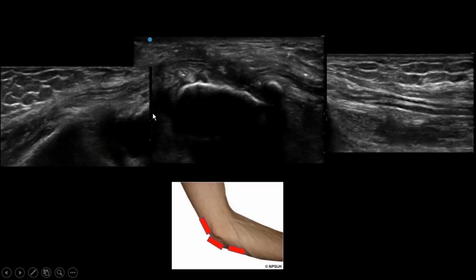Looking at this nerve, this is a long axis view. That's the distal ulnar nerve. This is the medial epicondyle, and that's proximal. You can see right about at the level of the medial epicondyle, the nerve is tethered in scar tissue. There's a dense fibrous scar tissue. You can also see some tiny hyperechoic signals, which are some foreign bodies, or maybe because she had a fracture in that area, maybe some small loose bodies, but the nerve is trapped here in scar tissue and tethered to this area because of this dense scarring.